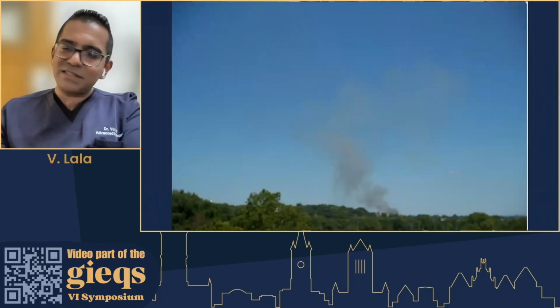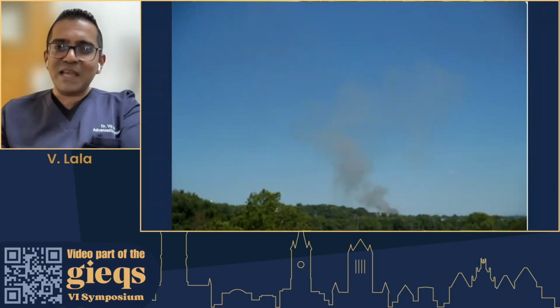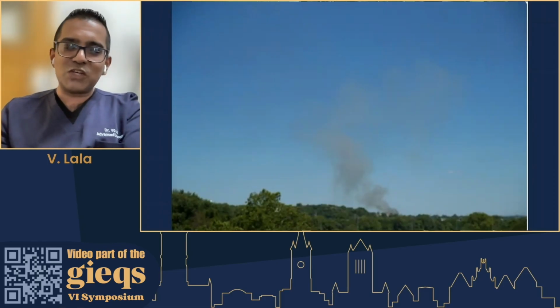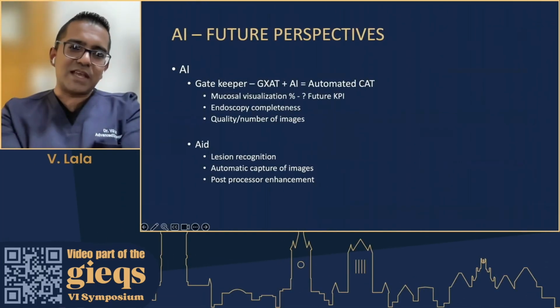And you actually can miss stepping even more back. So if you're busy looking at the leaves, you might actually miss the smoke, which tells you the forest is on fire. So step back, do overview pictures, look for the smoke. If you can't find the smoke, then there is nowhere to guide your closer images. So you need to be able to find the smoke before you can look at the leaf and find the source of the fire. Just where does AI tie into this?